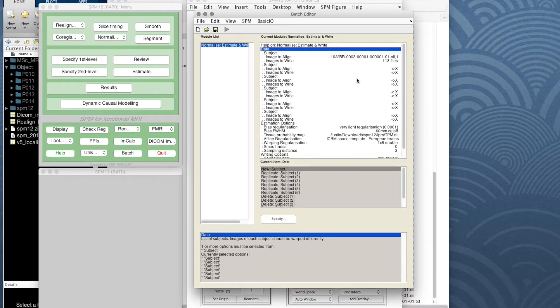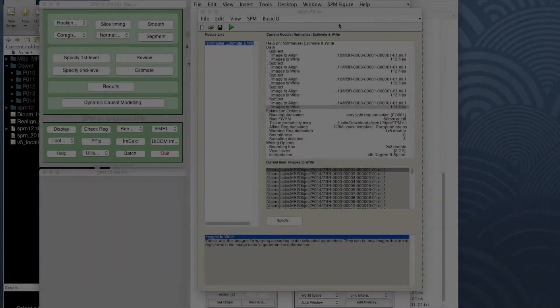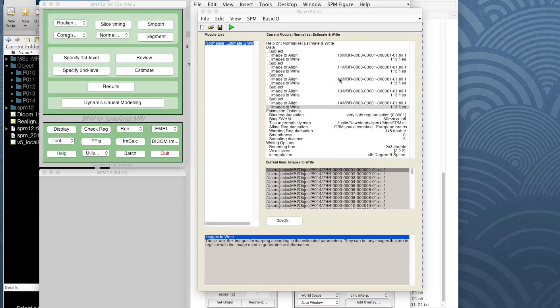I've now specified the files for all five participants. The first is participant 10, then participants 11, 12, 13, and 14. In each case the image to align is the first in the sequence. If you've realigned and resliced images you often produce a mean image of slightly higher quality due to reduced noise, but we haven't done that, so we use the first in the sequence. The images to write are all 113 for each of the five participants, and for now we leave all options as they are.